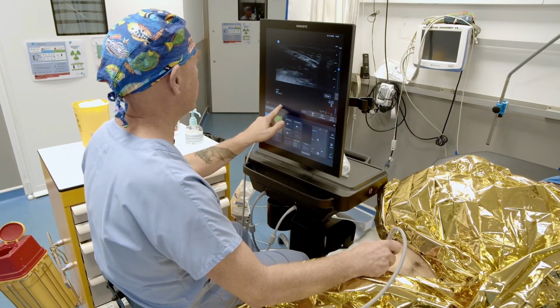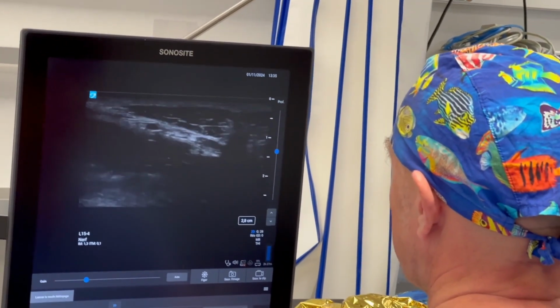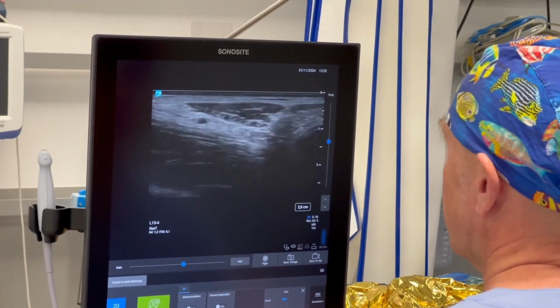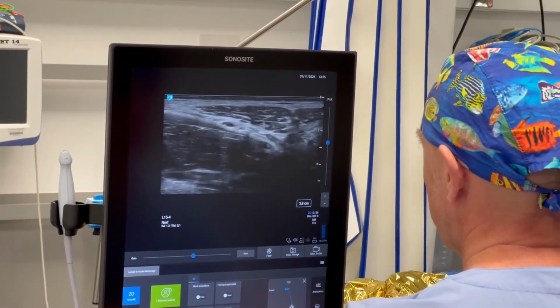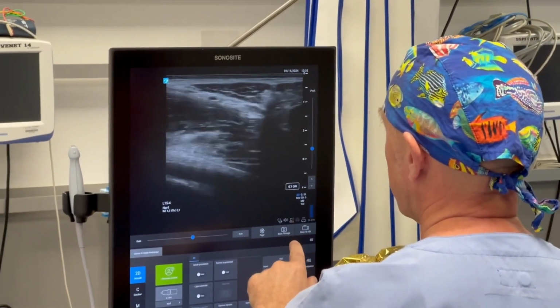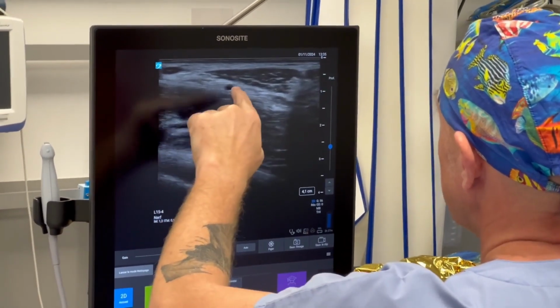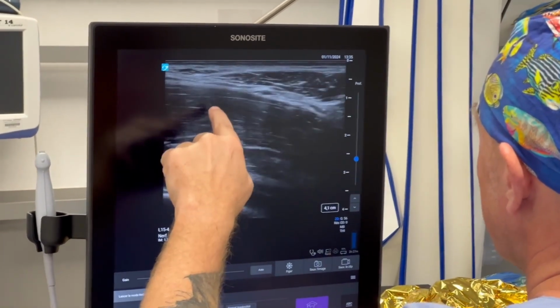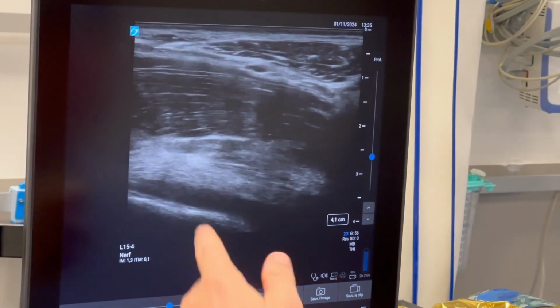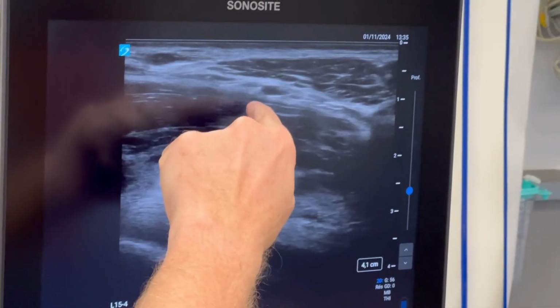I currently have a bit too much gain in the depth, so you can manually adjust these settings there, though maybe that is not quite enough. I really hope you can see everything quite clearly on the screen. There, I will add just a bit more depth to the image. There we go, that looks much better now. To show you, my main landmark is the circumflex artery. Now, in Sam's case, we can see it very, very clearly. And then we have the large iliac muscle coming in, so that's really the typical description. And then the anterior superior iliac spine.